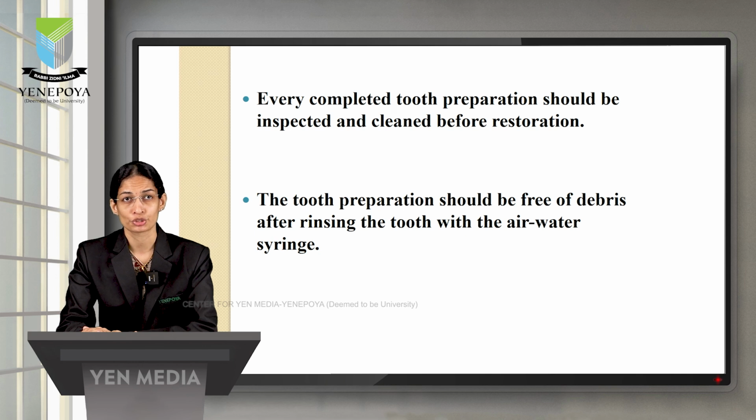Every completed tooth preparation should be inspected and cleaned before the restoration. The tooth preparation should be free of debris after rinsing the tooth with an air water syringe.